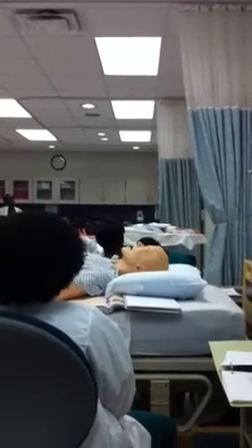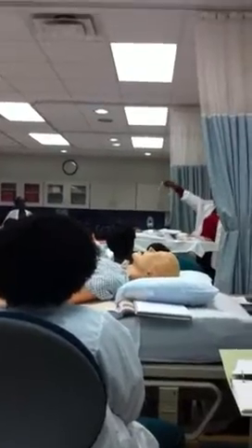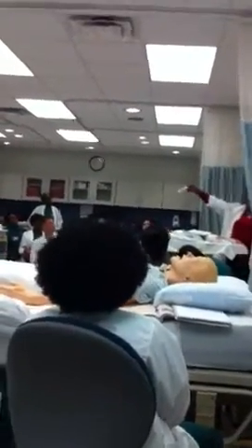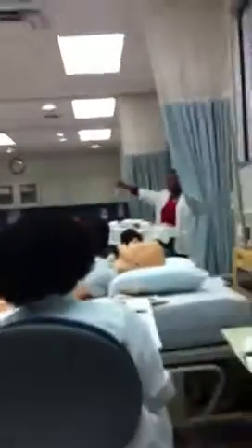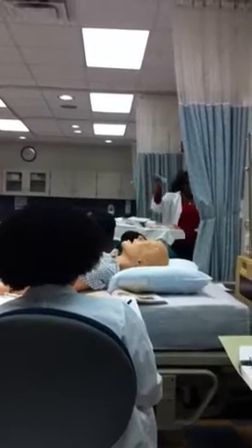Insulin syringe. This is everywhere that you go to, nursing homes, hospitals. This is only used for insulin, guys. Alright, you see it? It's only for insulin. Everybody see it? Yes. Only insulin. It's in units. It also has mL next to it, but mostly we use the units. Grab my insulin.